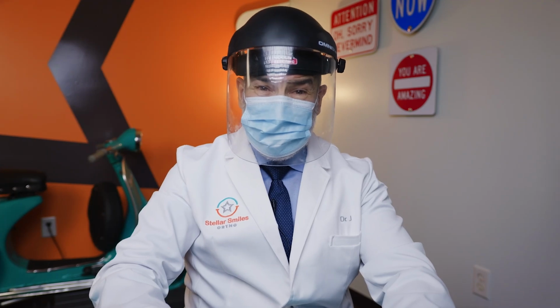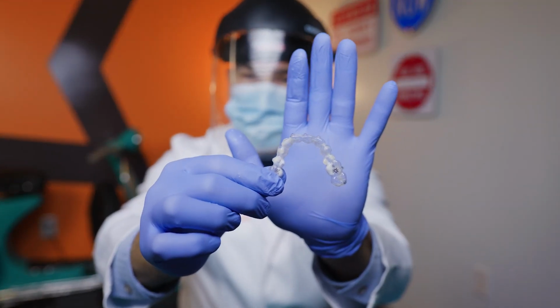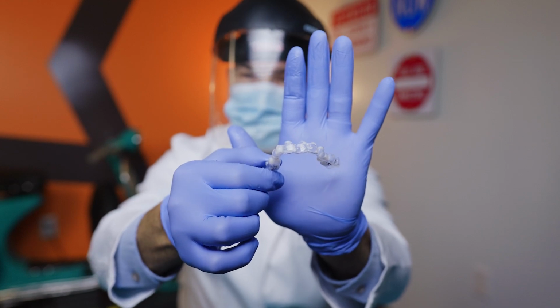Just like these M&Ms, food particles can get trapped in your aligners and attract all this kind of bacteria, and they lead to all kinds of dental issues, such as cavities and gingivitis, which is a type of gum disease. If you spill food on the table during a meal, you clean it up right after. Teeth are the same. You don't want food stuck to the surface or the table of your mouth. Here's how your aligners will look with plaque in them, and just imagine all of this is pushed up against your teeth and your gums. Yuck.